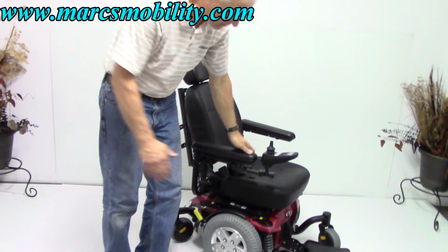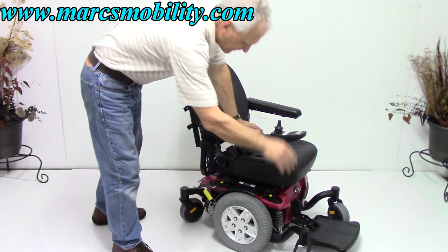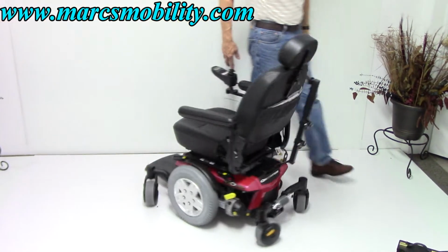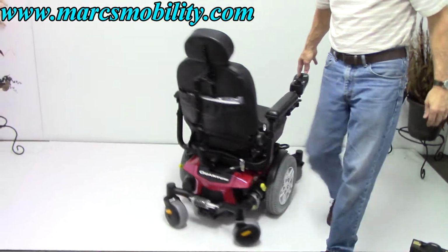You can see that this is called a mid-wheel drive chair, so that your drive wheels are in the middle. So this chair will turn on its own length. So you can see, if I had a box here and a box in front, it would turn all day long in that circle right here.